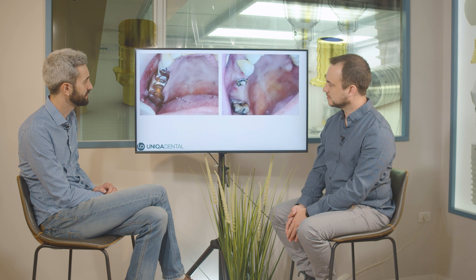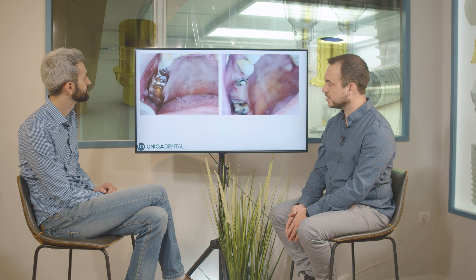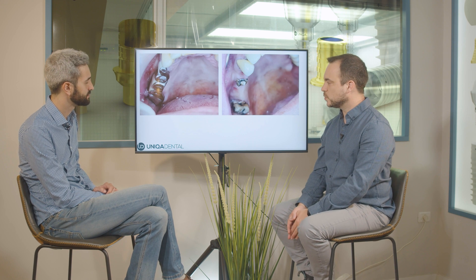The bone is okay, which is quite surprising, because in many cases when a bridge has no pressure — when the bone has no teeth or implants applying pressure — you have some bone resorption. So in this case, the fact that we have enough bone is surprising, in the good meaning.